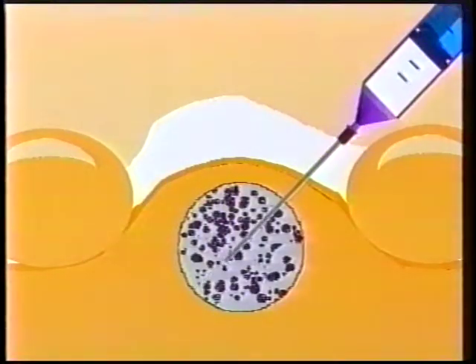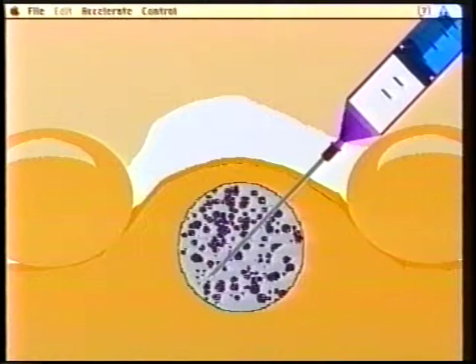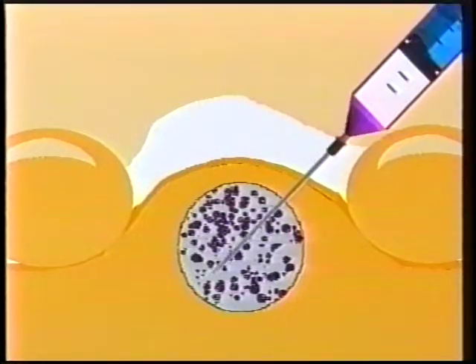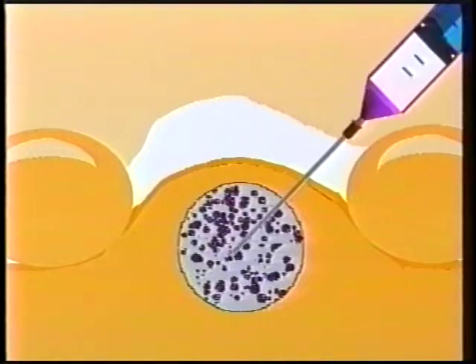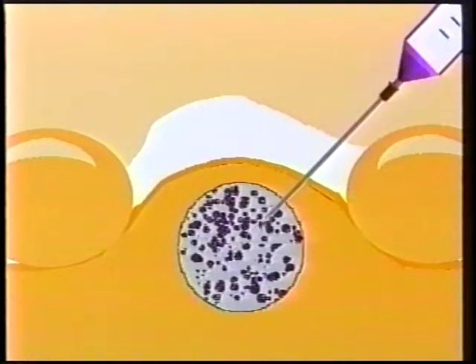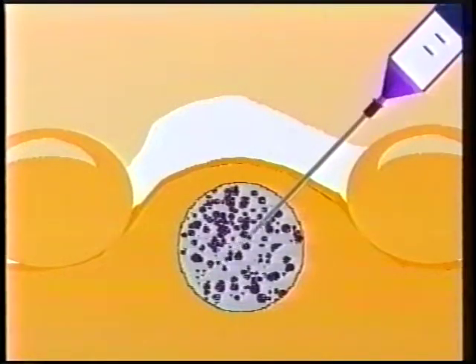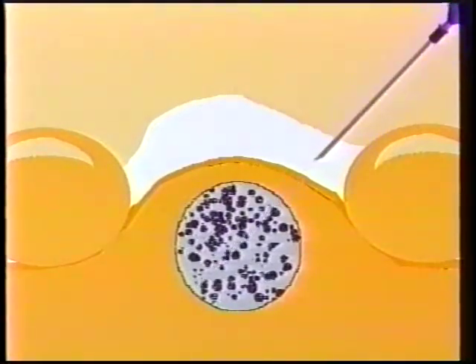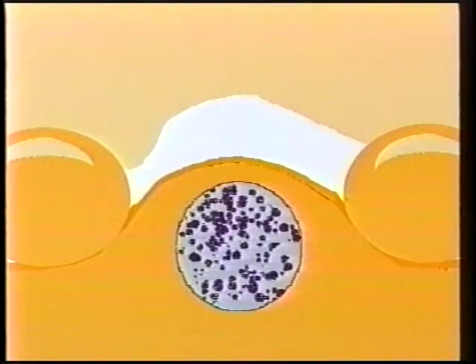Then the needle is moved back and forth, taking care to keep the tip inside the boundaries of the lesion. 15 to 20 excursions are done routinely before the suction is released and the needle withdrawn. If blood appears at the hub, you may want to limit the number of excursions to between 5 and 10.